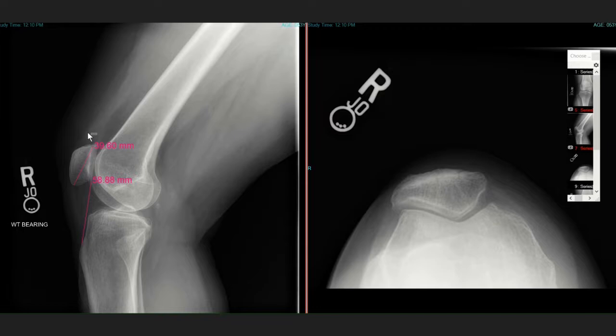Well, what about trochlear dysplasia? Does this examinee have trochlear dysplasia? Well, the first thing we assess for is the patellar alignment, the patella apex, where the patella should be centered with the apex of the patella here directly above the deepest section of the intercondylar sulcus.